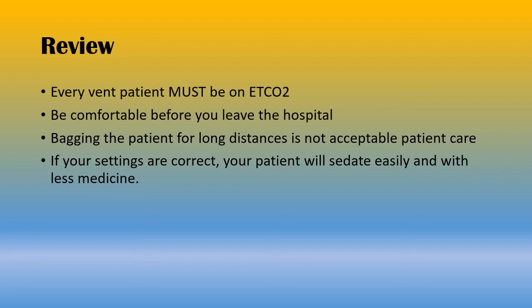Set the ventilator up at the bedside and make sure the patient's going to ventilate well before you leave the hospital. Once you leave, you're on your own, whether you have to bag them the whole way or fight your ventilator or whatever, but you're on your own. So make sure you're comfortable before you leave. Bagging the patient for any length of time is not acceptable patient care. It's not the standard and it's bad.